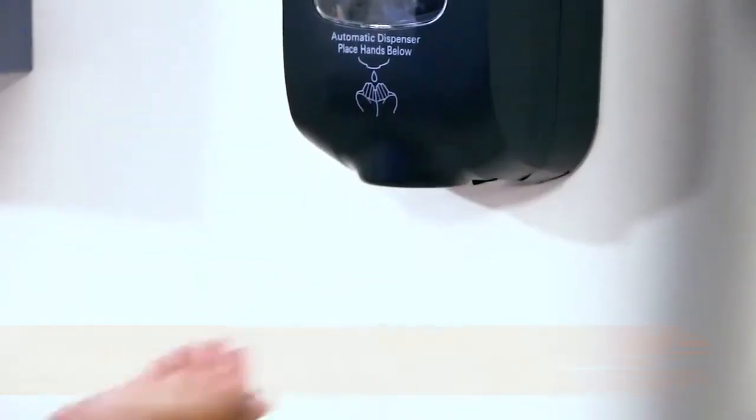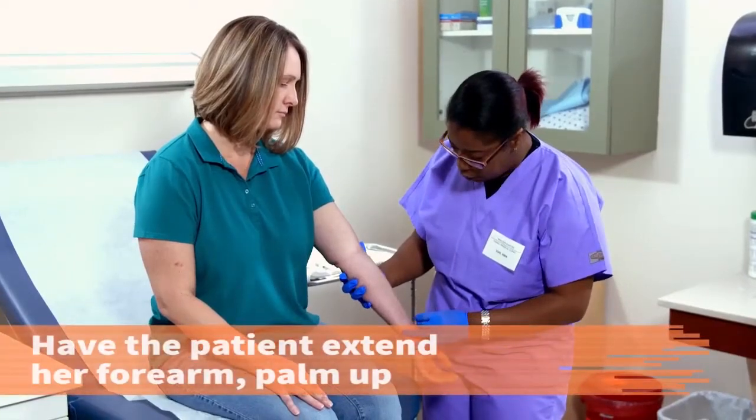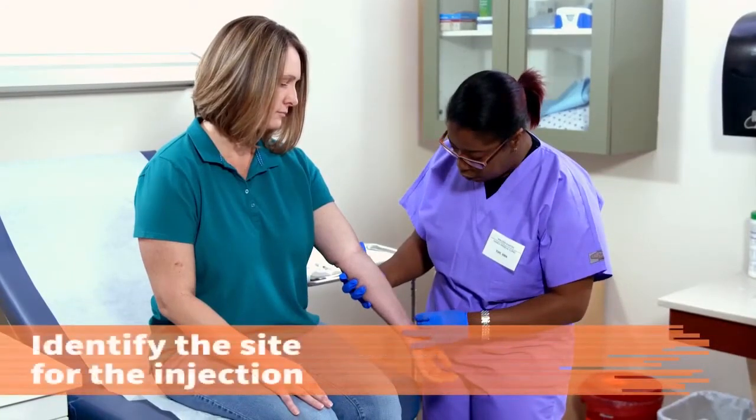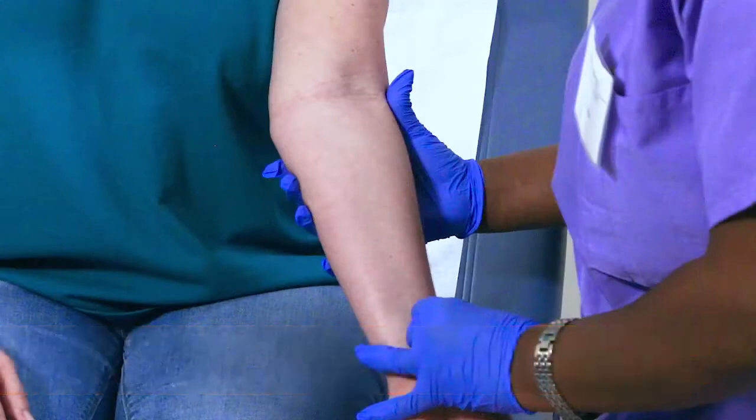Sanitize your hands again and put on gloves. Have the patient extend a forearm with the palm facing upward. Identify an appropriate site for an injection. The site should be 2 to 4 inches below the elbow, free from veins, scars, or wounds.